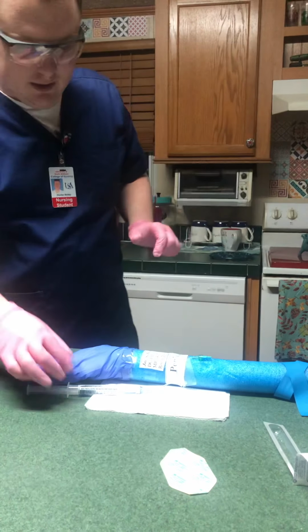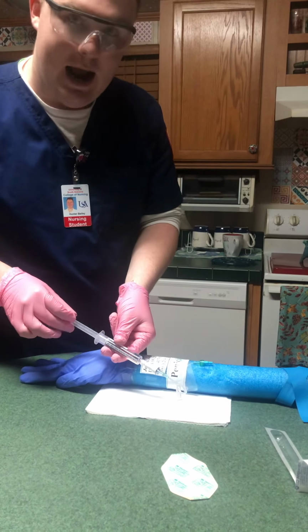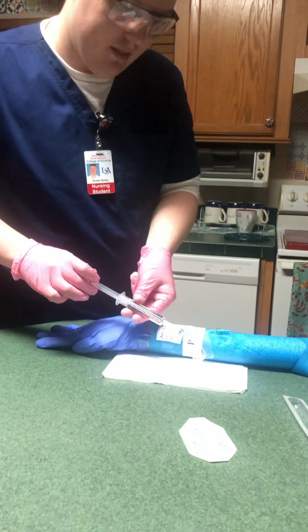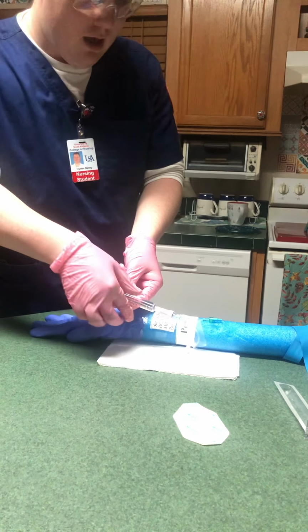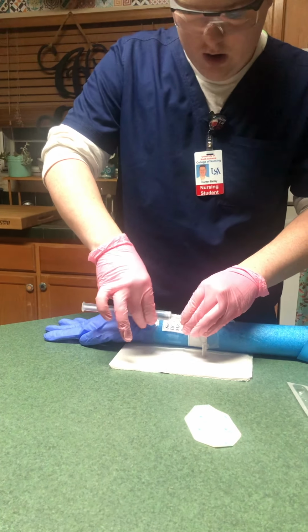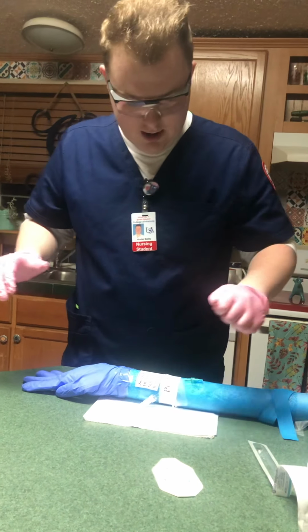Okay, so now that it's in, what I can do is I'm going to get my saline flush, and I would pull back and aspirate for blood return, and then I would flush it out with the remaining saline. And so now I'm going to take off the syringe, dispose of it in the sharps, and I can just let this sit right here.